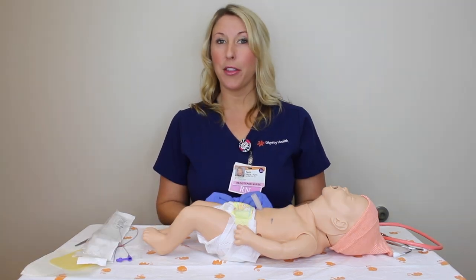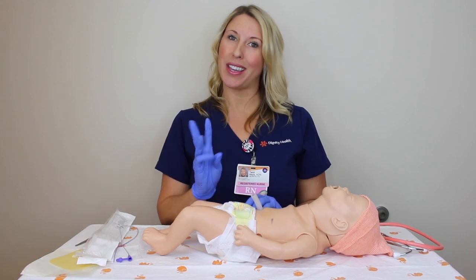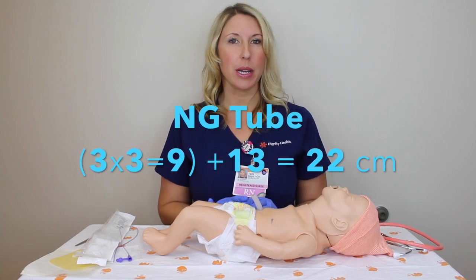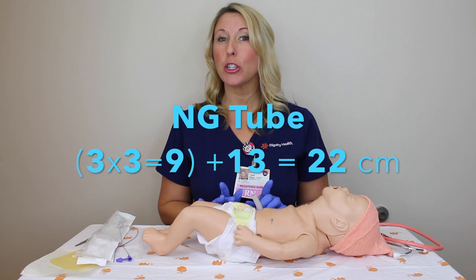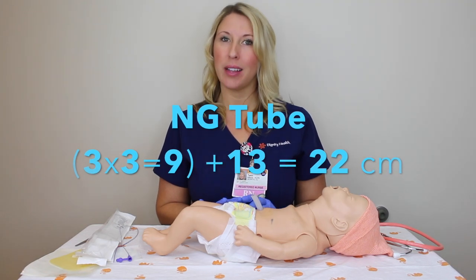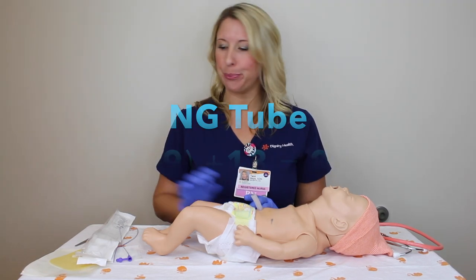Now that we know the formula, let's say this baby's weight is 3 kilos. 3 times 3 is 9, plus 13 equals 22. Let's go ahead and place our tube.